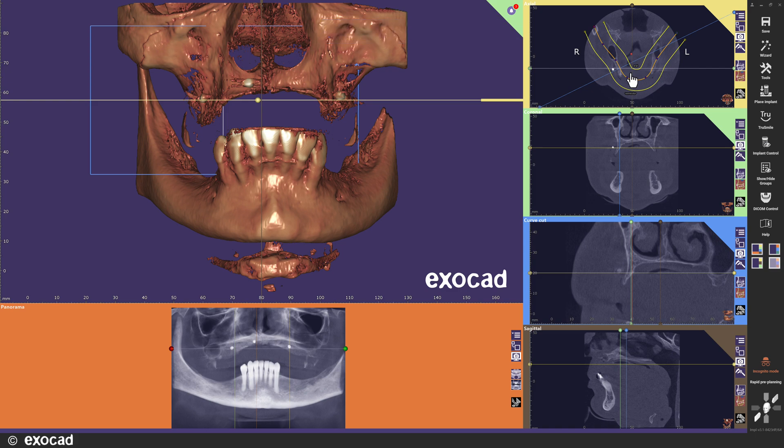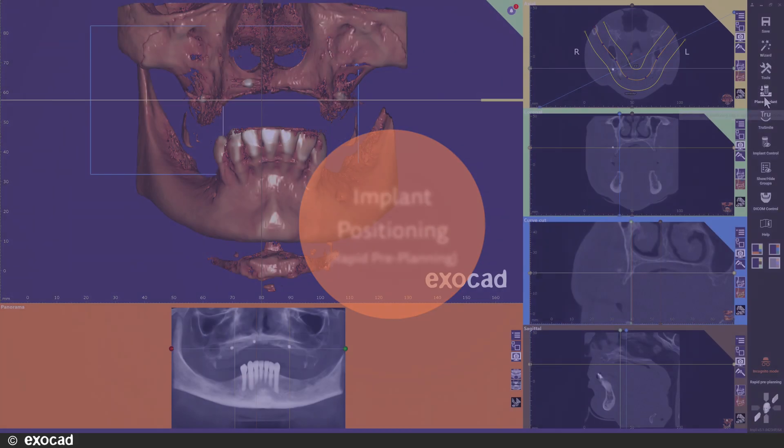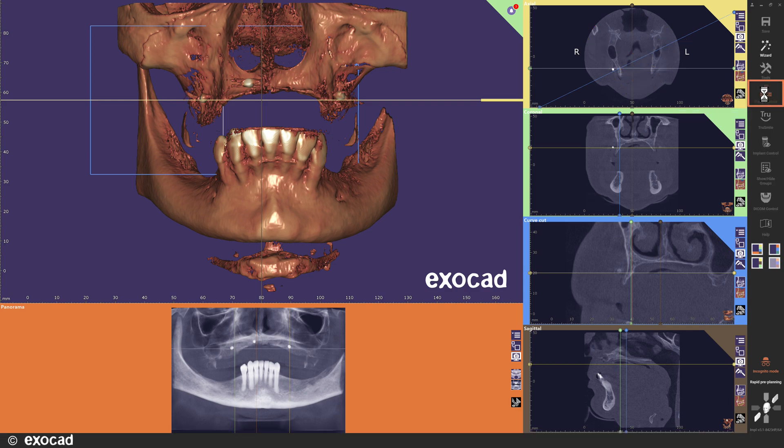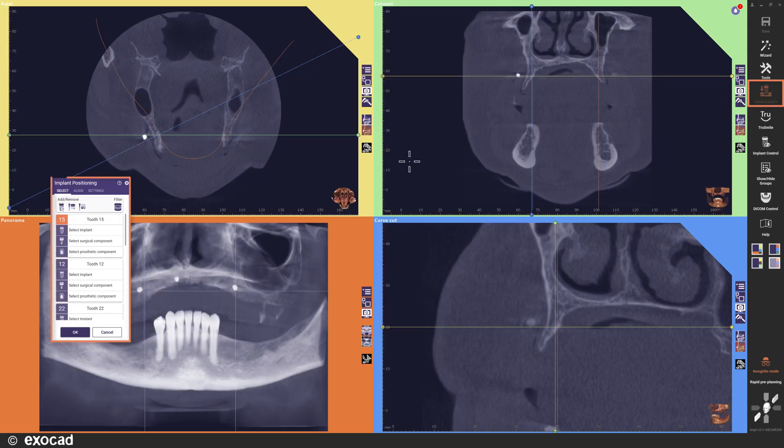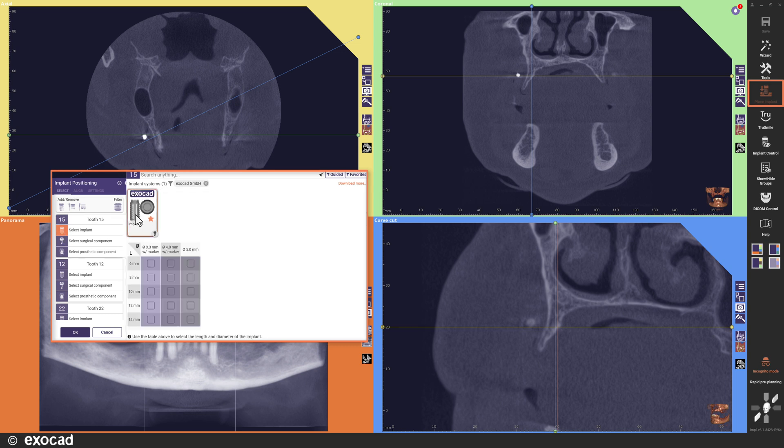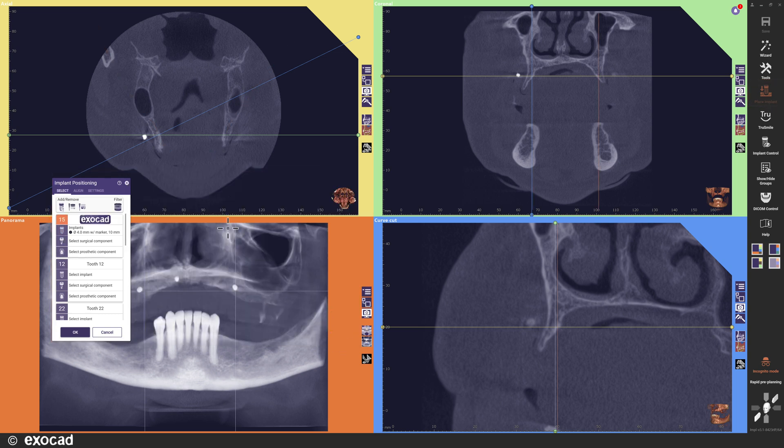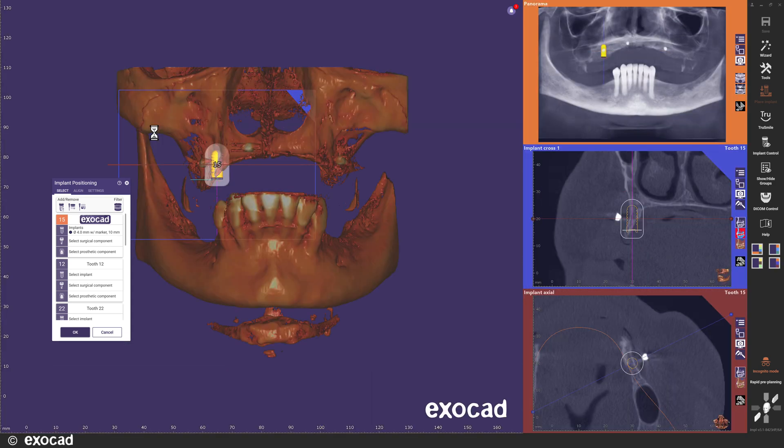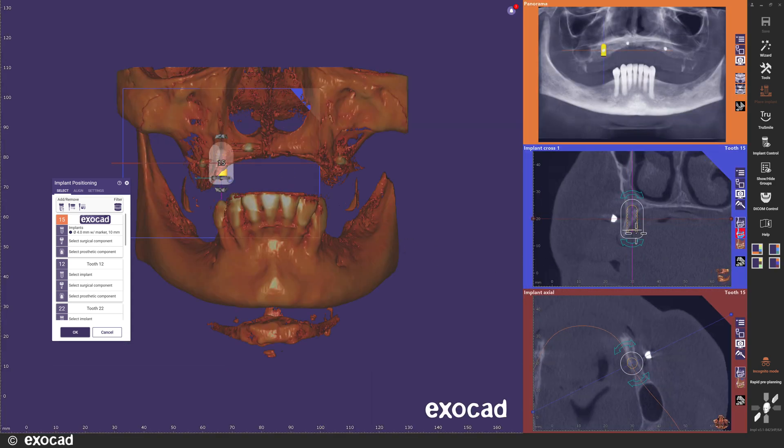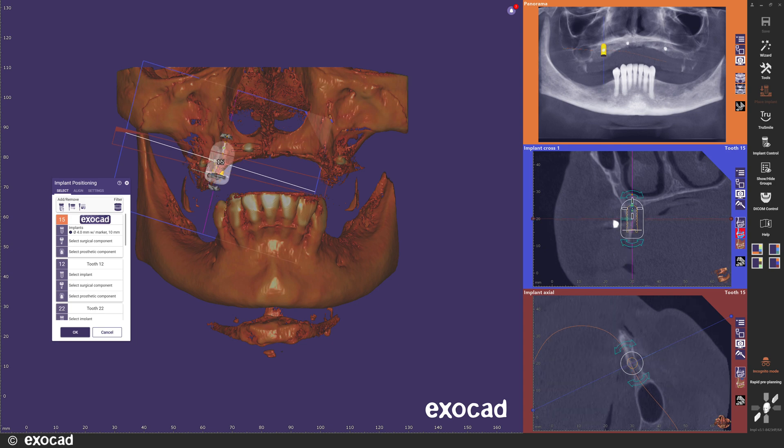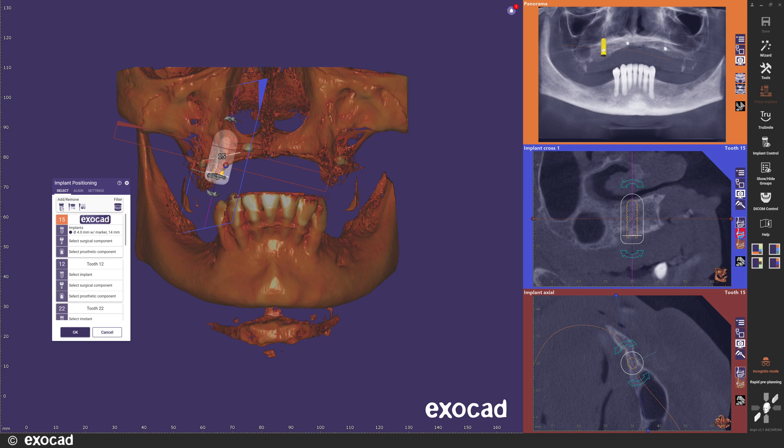When using Exoplan in the Rapid Preplanning mode, you can open the implant positioning step with this button without the need to go through all other steps necessary for a complete planning. As you can see, we have made several improvements to the implant positioning step. For now, I will just select one implant and place it roughly. I do not need to place all implants and can simply close the implant positioning step when I have done the positioning I want.